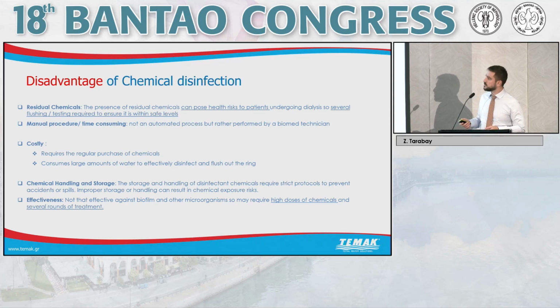Second of all, it is a manual procedure, and it's a time-consuming procedure. It's not an automated process, but it requires a biomedical technician to add the chemicals and to be present during the disinfection process and all the procedure required later on. It's also a costly process.